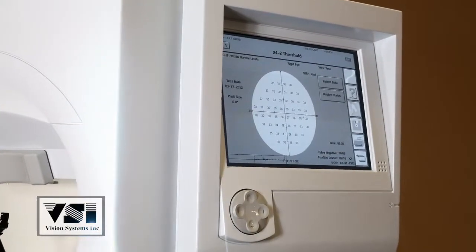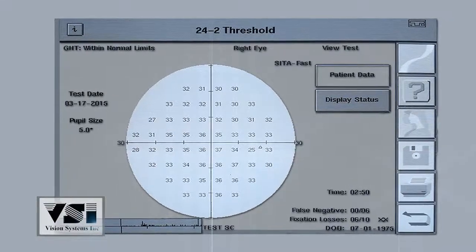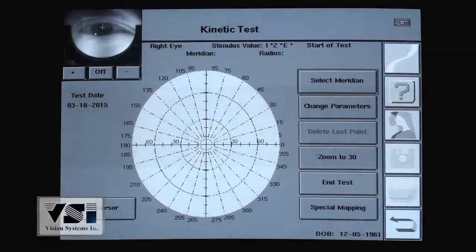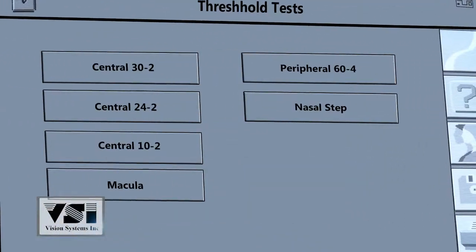Along with foveal threshold testing, the 740 offers an extensive library of testing strategies including the macula and nasal step tests.